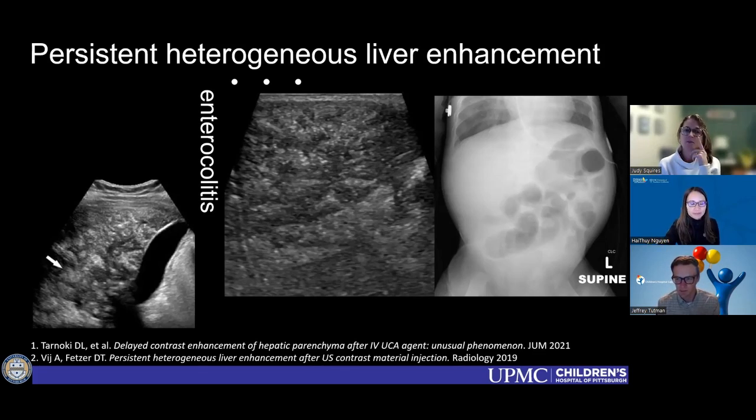I don't have any examples on hand to pull out, like Judy, but maybe I'll start clipping them and collecting them. Depending on what you're comparing it to, sometimes if I'm lucky, it'll be next to a vessel. So I'll place the two ROIs, and then you can see if one enhances or not relative to the vascular structures. Similar to what you would do with a liver lesion, you put it on a normal parenchyma versus the lesion itself and just see how it enhances. So I just use the two, the more normal-ish and then the abnormality that I'm comparing. And then I see quantitatively how those curves appear.